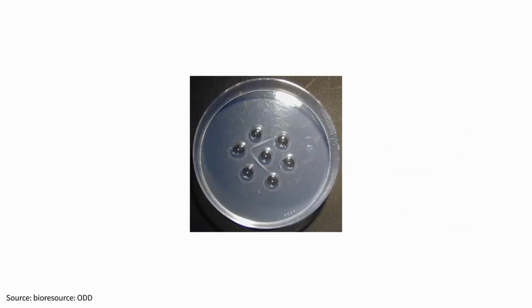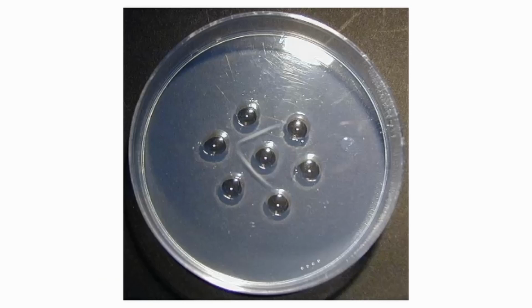In this final picture, I put it in just to show what this test looks like in the real world. So there are these white lines, those are the bands, and then you can see the wells in the plate. That is where the antigen and patient samples are loaded.